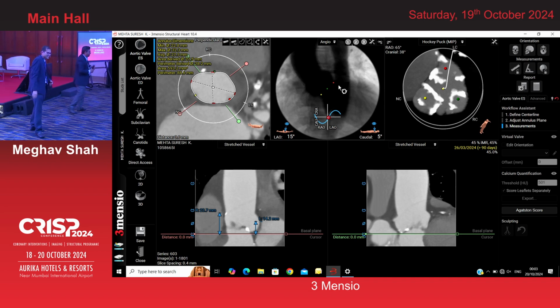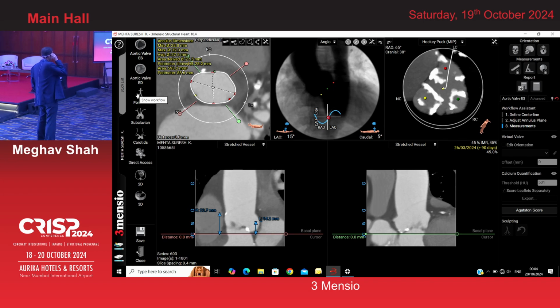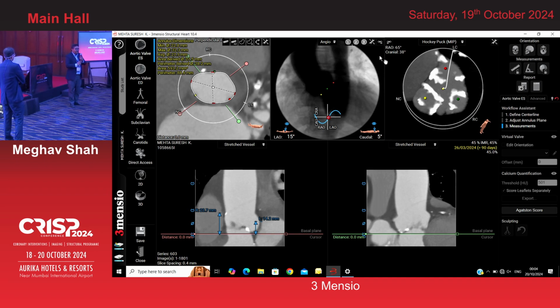I am very much interested in these S-curves. The value of these S-curves is understanding everything in structural cardiology. The value of these S-curves is merging the views of an imager and an interventionist. The value is in understanding that whatever you are looking at on fluoroscopy, on TEE, on transthoracic imaging, on CT scan, or on a heart from a mortuary, everyone is looking at the same heart. So I should be describing it in the same way.